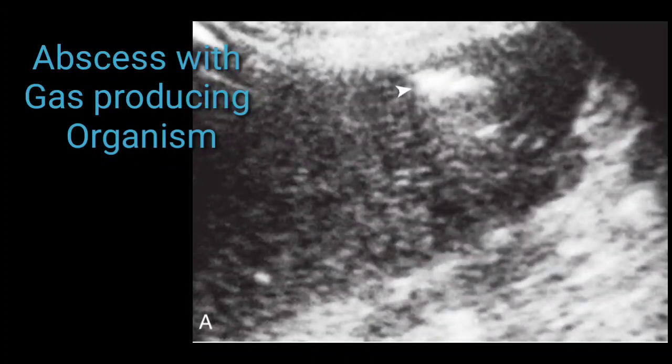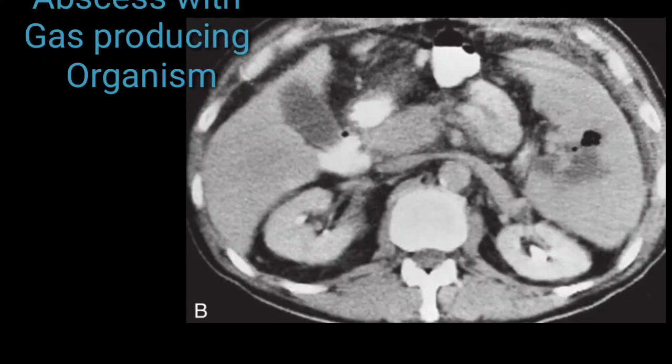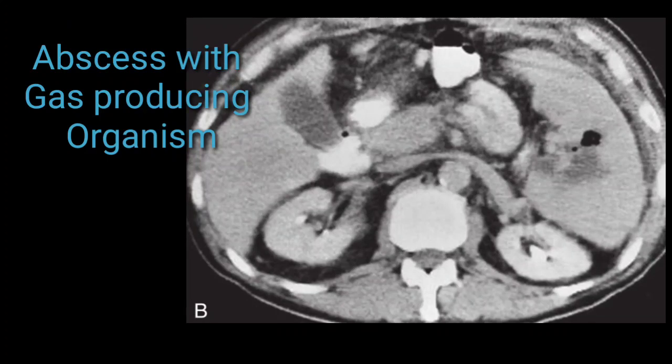For further examination, CT was advised because CT is the reliable method to confirm the abscess, and also to confirm the gas producing organisms.